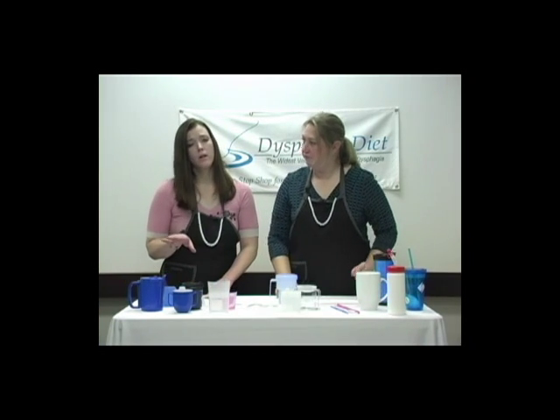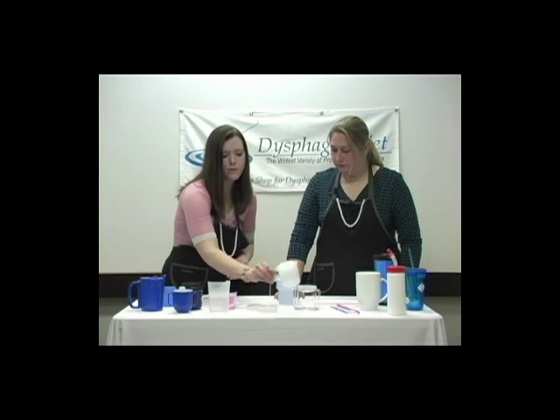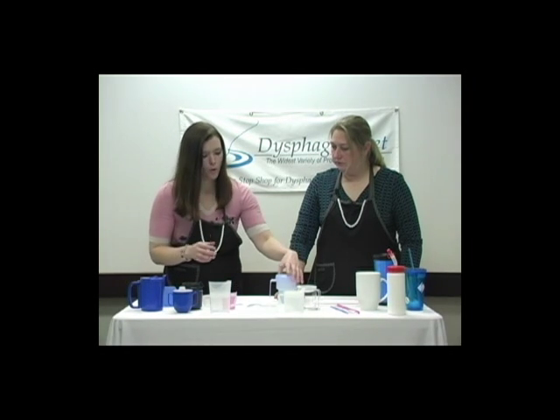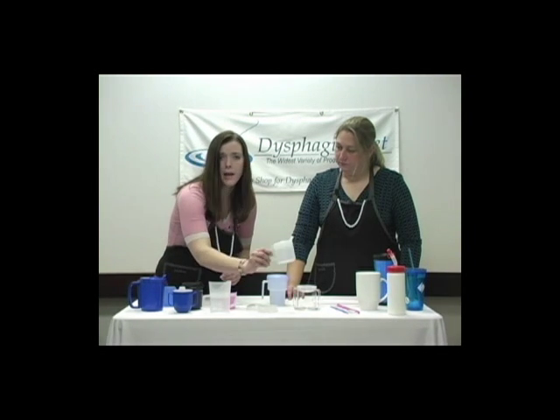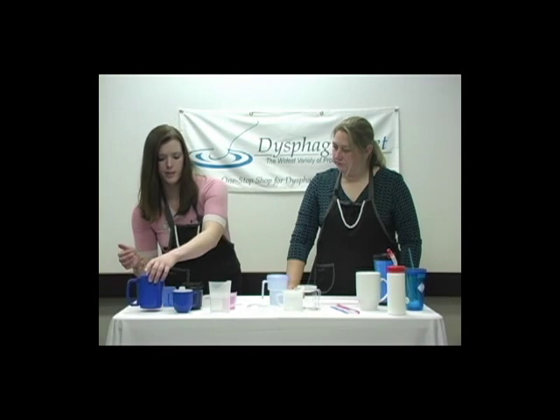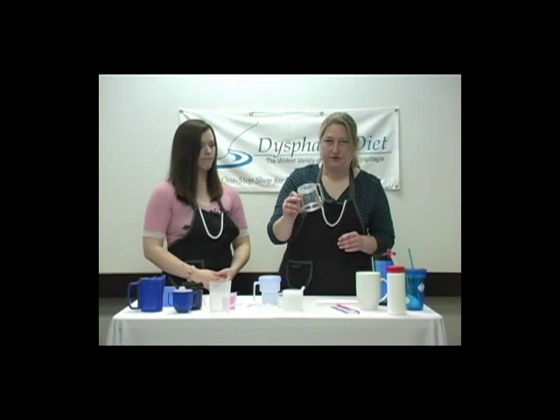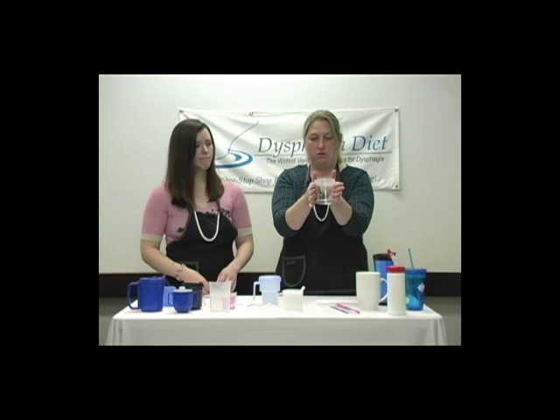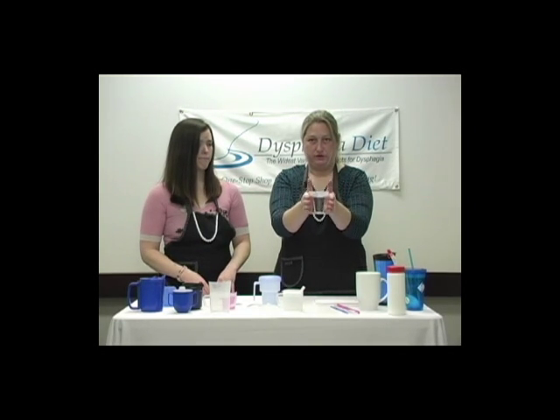And when you're talking about mugs and handles, there are just a lot of different styles out there. You've got single side handles, double side handles, and handles where it's open at the bottom. And the purpose of these is going to be to allow you to either grip it by the handle or in some cases get your hand all the way through and use the handle to stabilize the cup. For example, this two-handled cup here you can wrap both hands around it like so, or you can just put your hand straight through it and your hand is going to support the mug just on its own.